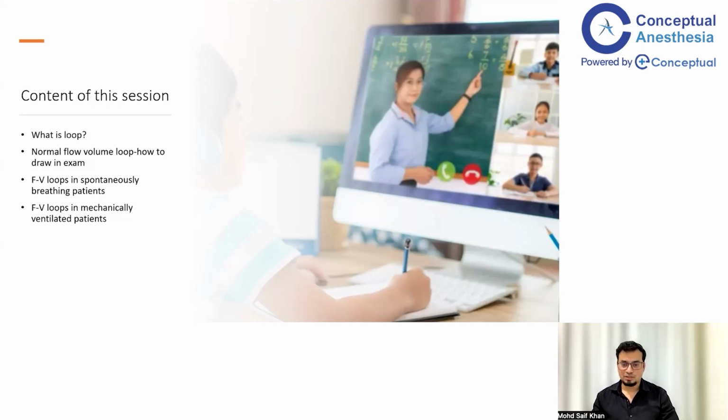So let's understand what a loop is. The flow volume loop is basically a type of loop. A loop is a real-time graphical representation of two variables plotted against one another. So two variables which are plotted against one another over the graph, that is your loop. What are the variables which are important in respiratory physiology? It could be pressure, it could be volume, and it could be flow. So flow, pressure, and volume.